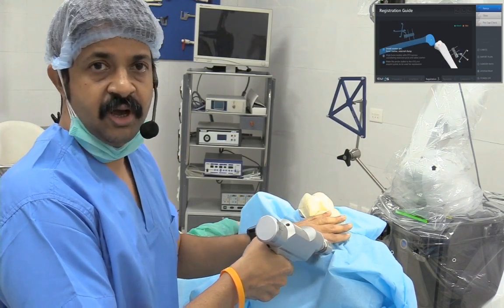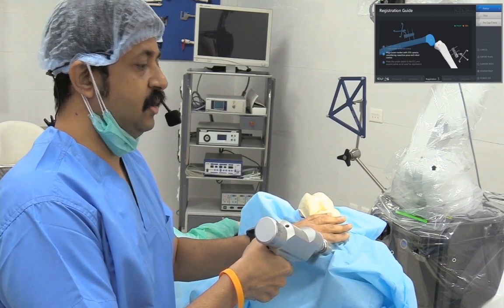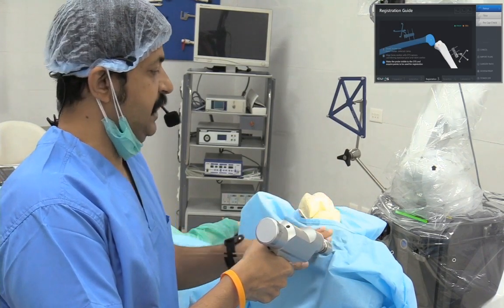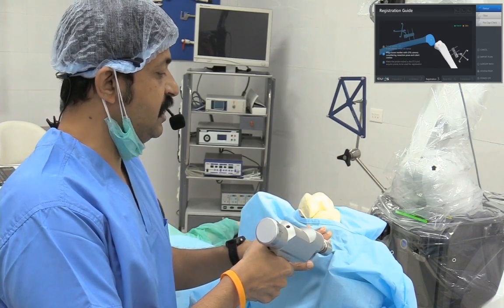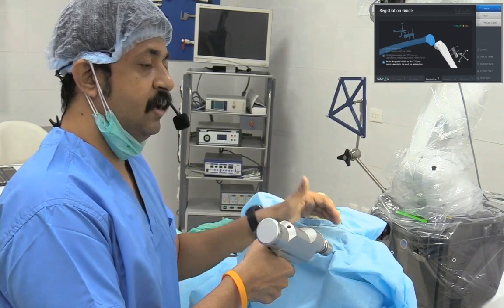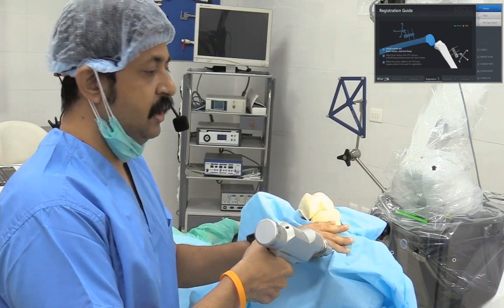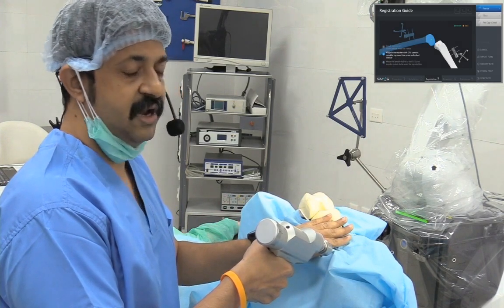At this stage, I would like to show you that the computer is absolutely on an autopilot mode. It tells you that the robot is now ready, everything is done, you are in good shape, and this is the time that you need to do the registration, as you can see on the screen. So at this stage, an incision is taken. Whatever incision is fine, whether it is medial parapatellar or your MI incision, if at all those incision types are acceptable to the system. There is no limitation on that.